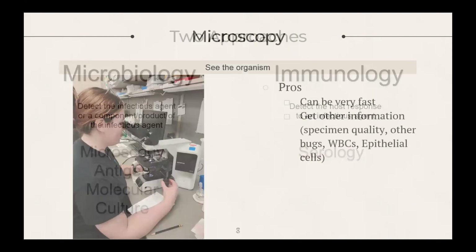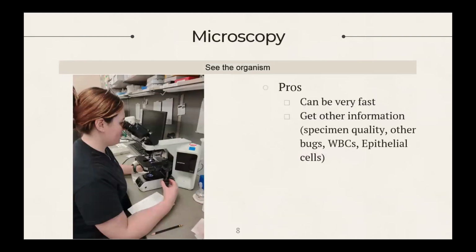So I'm a microbiology person, so this is what we do. Here's Lindsay here. She is doing microscopy, reading gram stains. She's looking for the organism. Microscopy is where you're actually going to go in and you're going to see this organism under the scope.